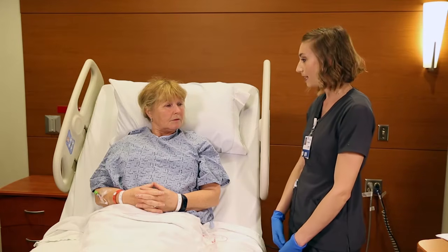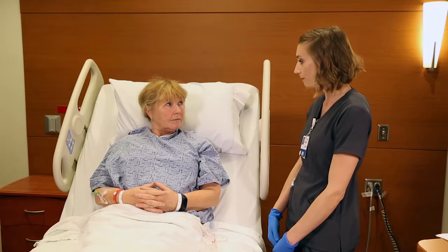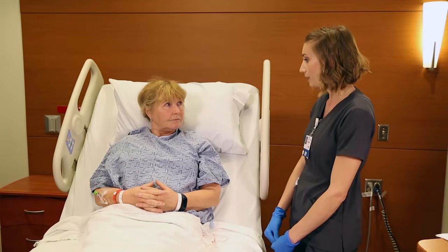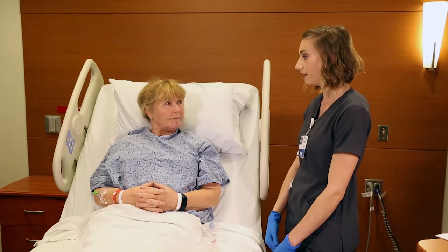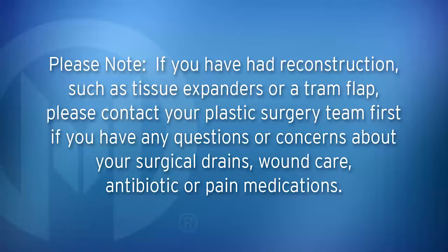That old drain site may take a couple days to fully close, and it may ooze a little fluid, and that's all normal. You want to keep that drain site clean and dry. If you notice any swelling, sometimes this is a collection of fluid called a seroma, and that requires medical attention. So you're going to want to contact the clinic office as soon as possible. If you have had reconstruction, such as tissue expanders or a TRAM flap, please contact your plastic surgery team first if you have any questions or concerns about your surgical drains, wound care, antibiotic, or pain medications.